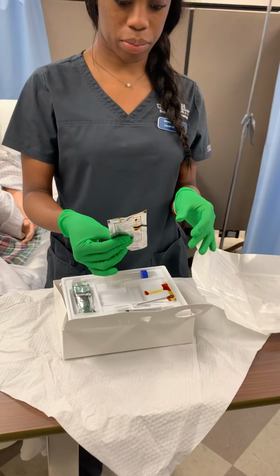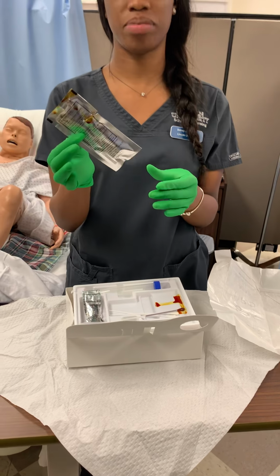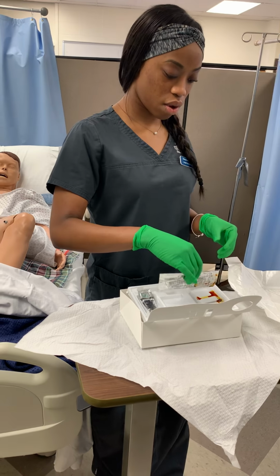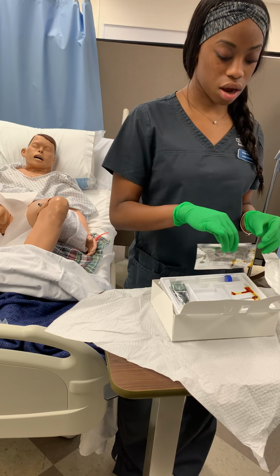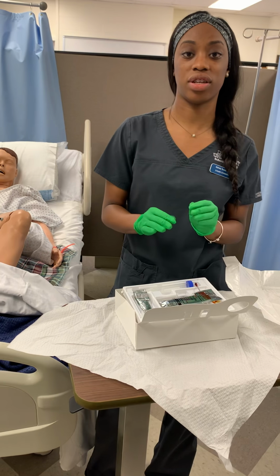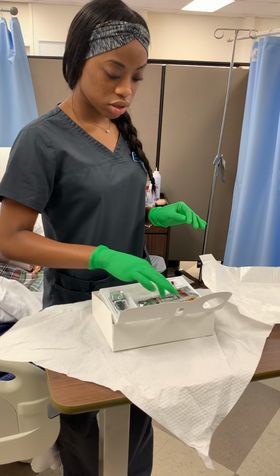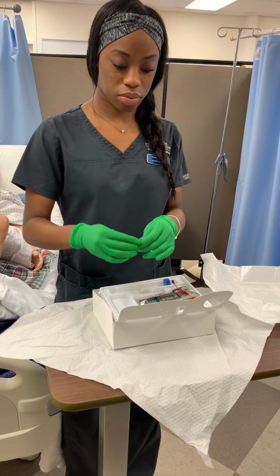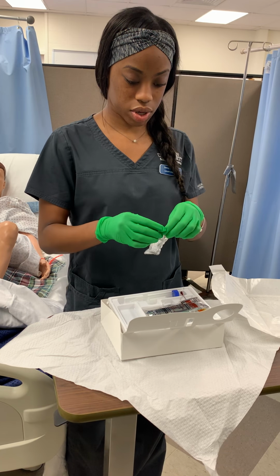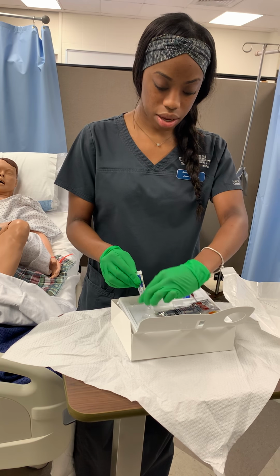Now you want to open up and set up. These are your iodine swab sticks. We won't actually use this on the mannequin, but I would pour iodine on the swab sticks. Before I do that, I'll make sure the patient is not allergic to any iodine or latex. After that, I would open my lubricant and set that up.